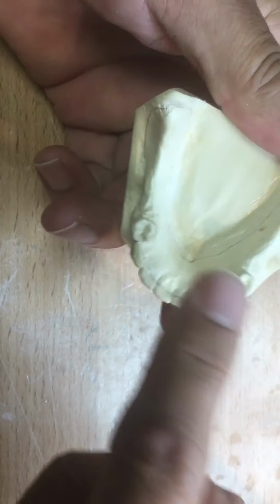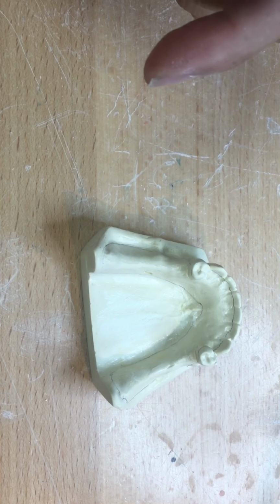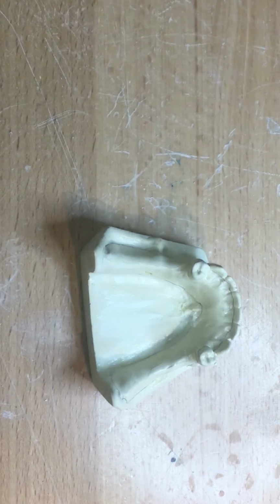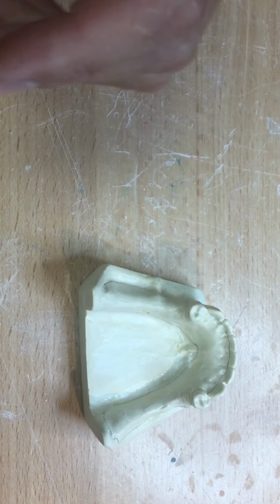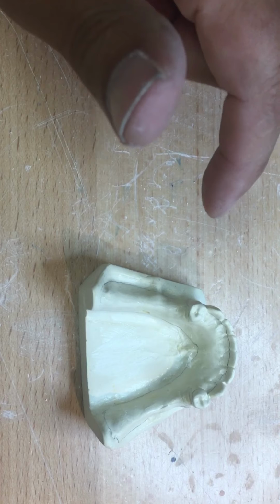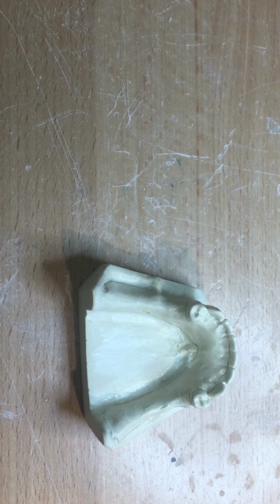I don't want any part of this model to fracture. This is my final impression. I'm going to create a cast partial denture on this final impression. So I can't have any of this model chip, break, abrade, wear down. Therefore, it's going to create an inaccurate framework. As you see all the procedures subsequent to follow, there's 29 steps, if not 32, that we're going to have to go through where these errors could occur. So you've got to minimize each step, as each one increases your chance of error.